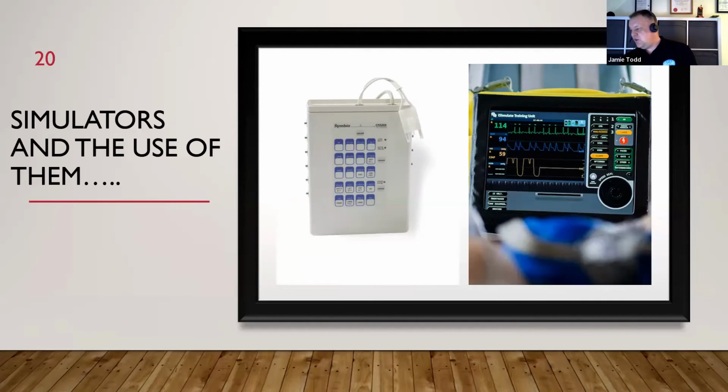There's maybe only one VT, and certainly one of the well-known ones doesn't have a selection of PEAs in it. You have to go randomly and find some other rhythm that looks regular and organized, and then change the rate, and then say there's no pulse, which is what a PEA is. But of course, that drives people to do it the easy way.